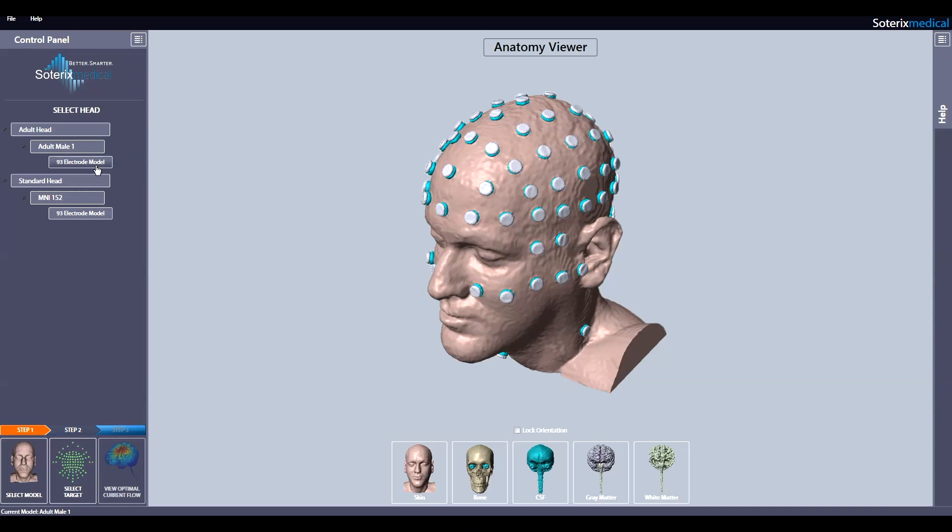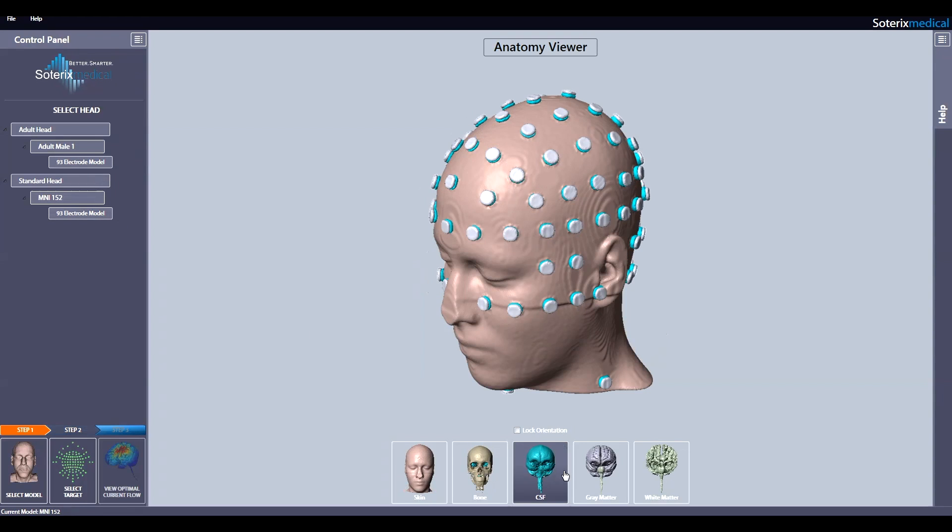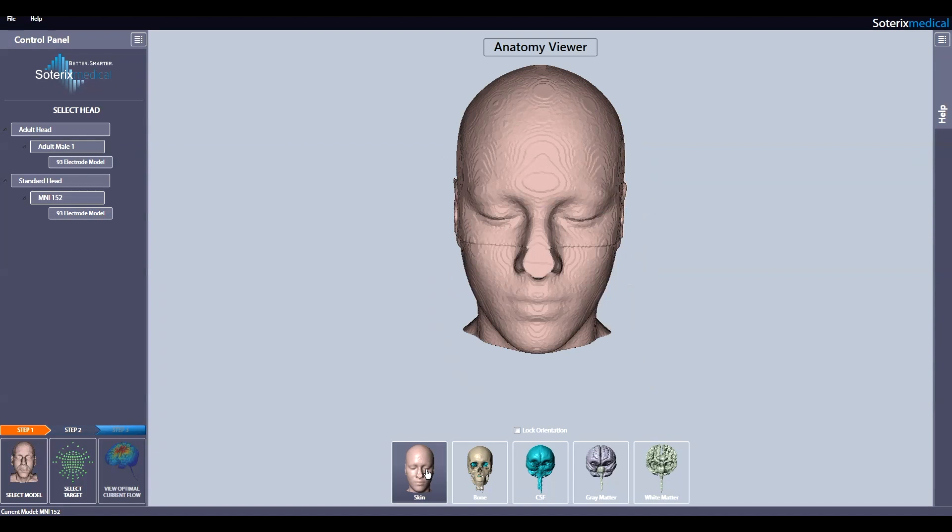Let's select standard head and the default 93 electrode density option. Once the head is selected, the different segmentation mask can be viewed in the middle.